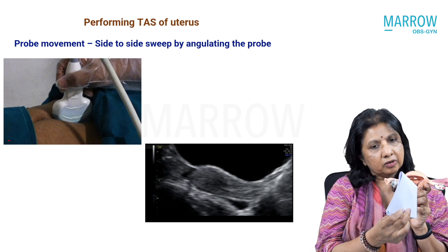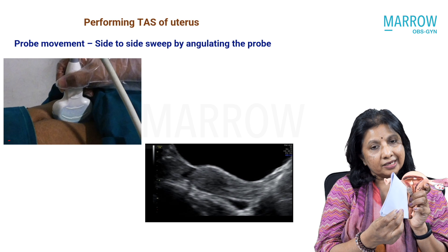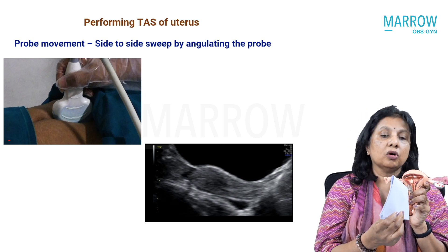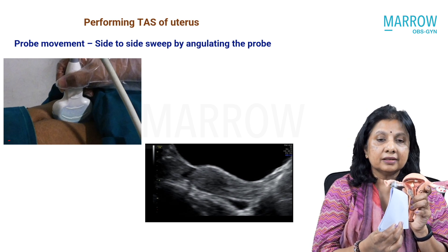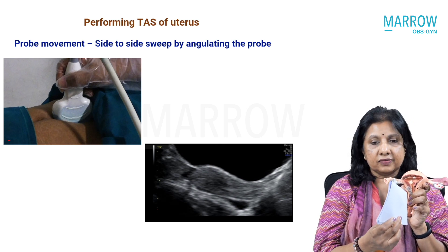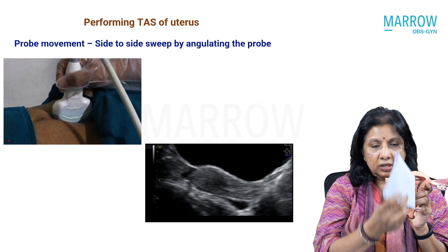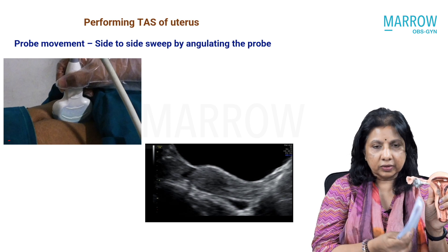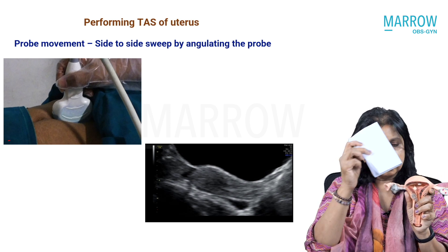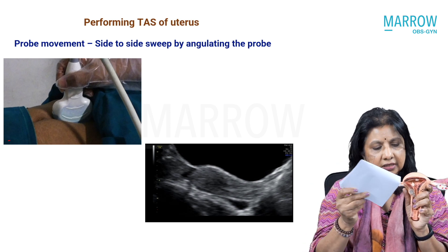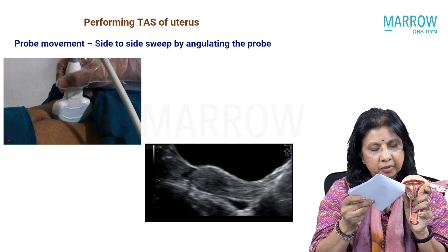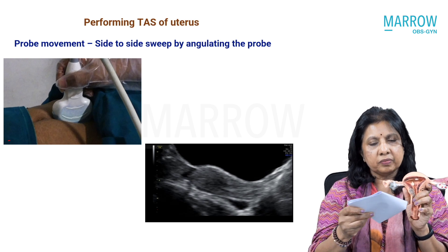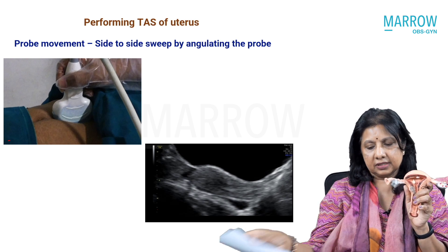Just because I'm moving right and left, I will not — and I should not — call it the right side and left side. On a sagittal plane, I only know which is anterior, which is posterior, which is the fundus, upper part, mid part, lower part, and cervix.